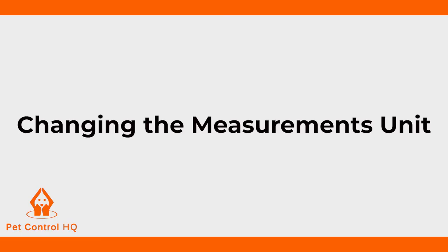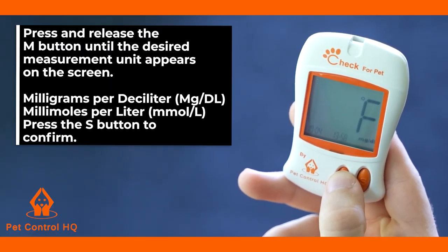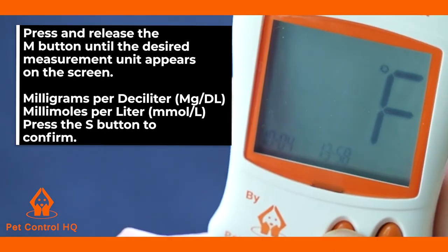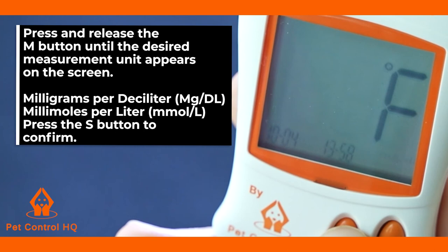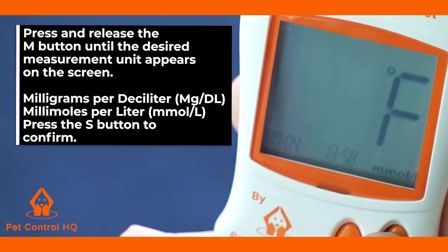The unit of measure setting will then be displayed on your monitor screen. To change the measurement unit on the screen, press and release the M button until the desired measurement unit appears on the screen — milligrams per deciliter or millimoles per litre. Then press the S button to confirm and exit the setting mode.